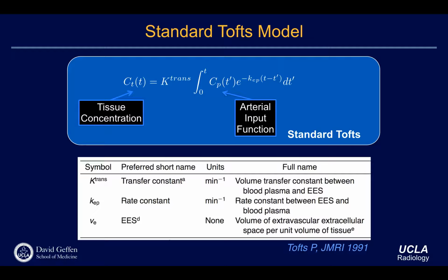Yeah. Any other questions so far? The natural question is, what about CP, right? I didn't mention anything about CP, and you magically assume something, but how do we know this CP? Because CP is important, right? This is the input. How much contrast agent goes into the vessel, right? If you don't know that, the whole equation will be messy, or the number will be very different. So how do we measure CP? Or how do we assume CP?